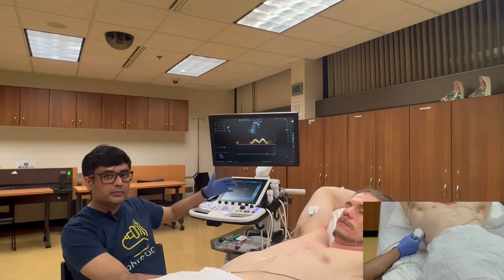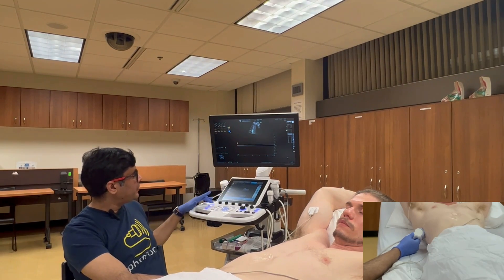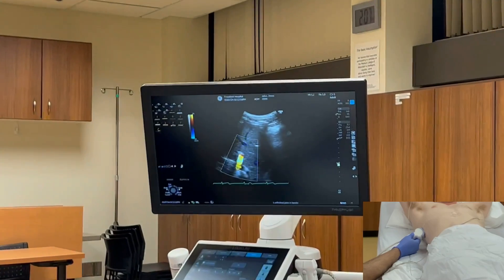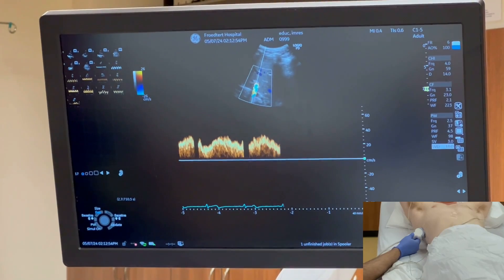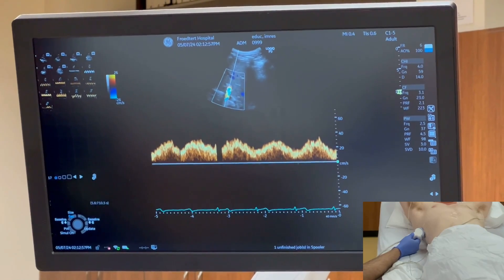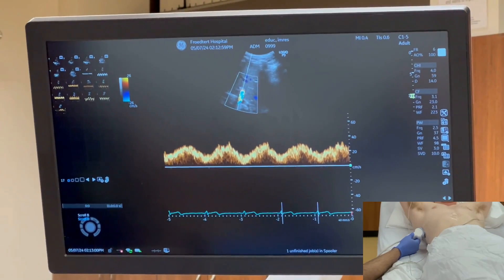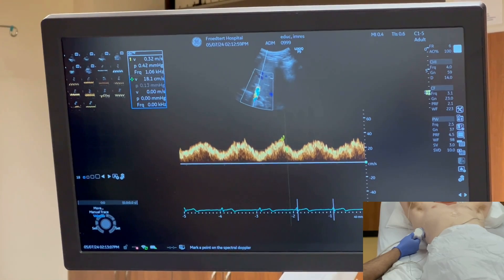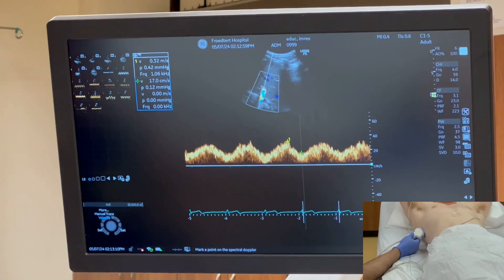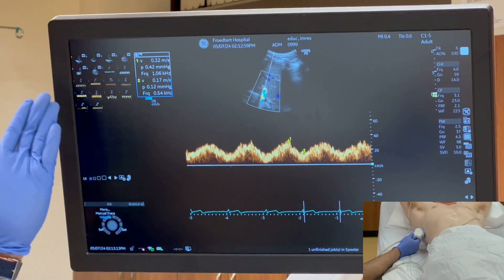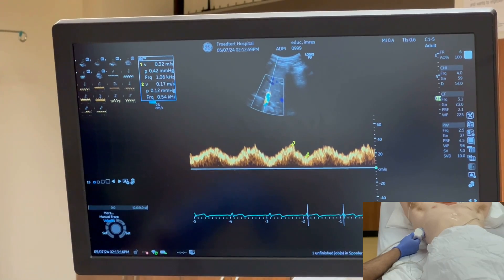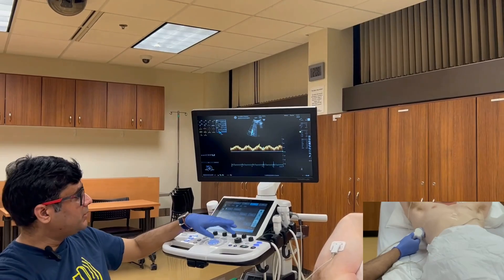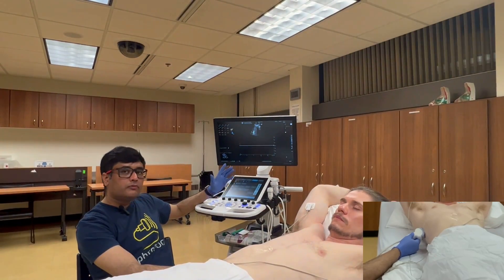Let's get the portal vein waveform in breath holding for a much crisper tracing. If you want to measure the pulsatility, go to the highest point in one cardiac cycle and the lowest point in the same cardiac cycle, and express it as a percentage. In this case it's approximately 50%, but in this subject it's completely normal. After the portal vein, I'm going to find the right kidney. The right kidney is easier to find in most cases because the liver works as a window to the kidney.